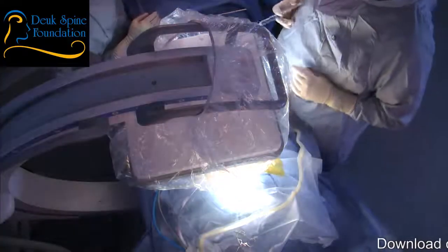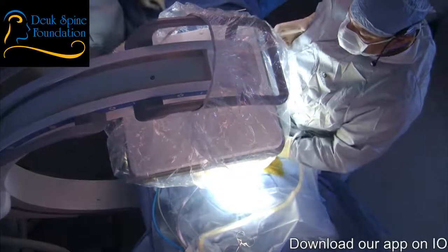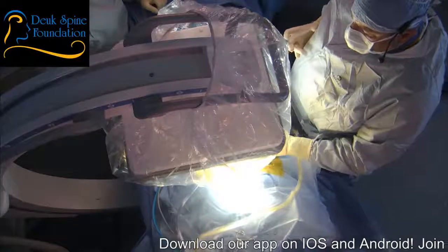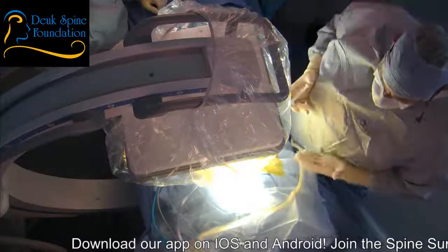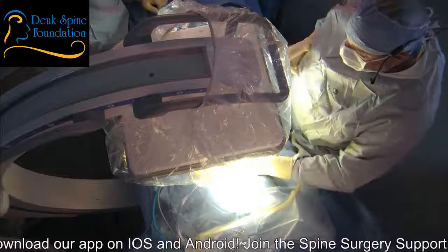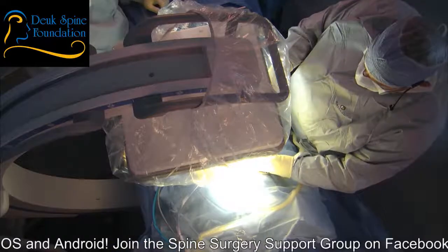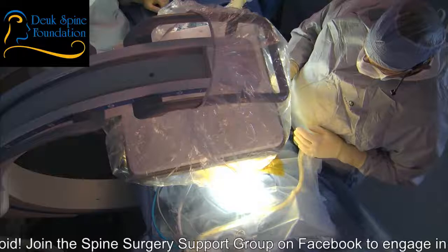Okie dokie, let's get started. You're going to feel my hand on your back. That's just my hand, okay? And I'm mashing around, feeling for things. Now, I'm going to give you some numbing medicine. You're going to feel a little stick and burn. Don't be alarmed. That's normal, okay? Don't try to move off the table. You got it? All right, so I'm going to start the numbing process now. Sorry about that. I know it's uncomfortable.